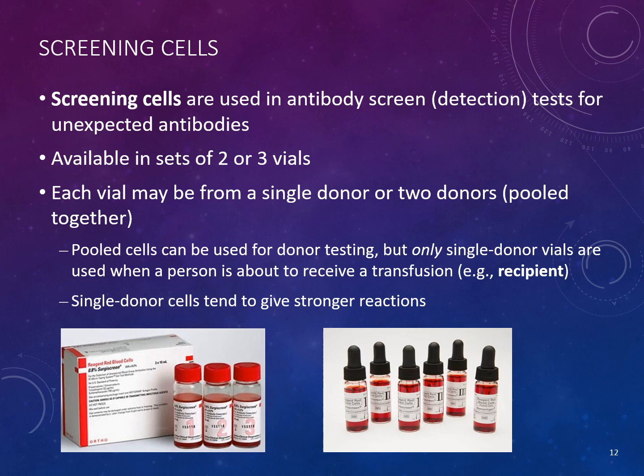Now, as you can see here in this image at the bottom, where I was just talking about making sure there's no hemolysis, these reagent red cells, this image actually comes from the manufacturer's website, but you can see here the supernate, this clear fluid in all of these tubes or vials, is hemolyzed. But if you look at the bottom of the vial, you can see where the red cells have kind of settled out. Now, you can occasionally have a little bit of a hue to the supernate, but it's never this bad. It should not be this bad.